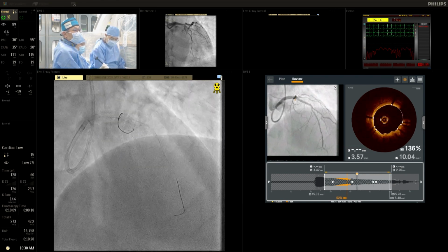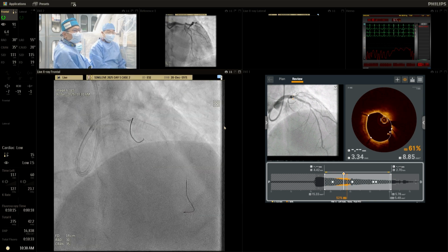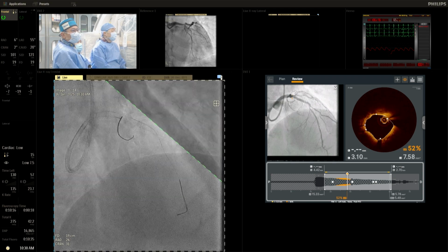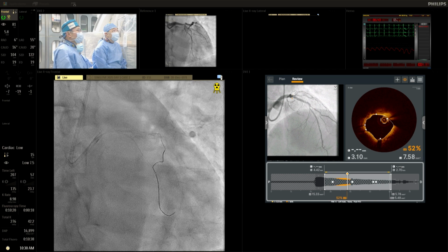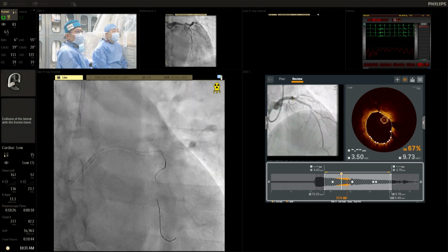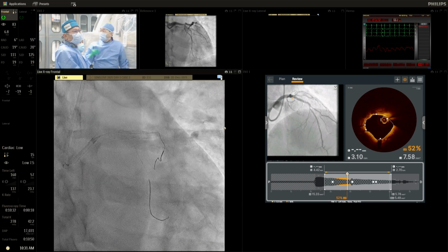We can see now that we have stented the lesion. There seems to be some under expansion here in the distal part of the left main. Not surprising, I guess, because there was eccentric calcification that hindered our full balloon expansion. It's a rather ugly number of 52% according to the AI. Can we get a new 5.0, please?